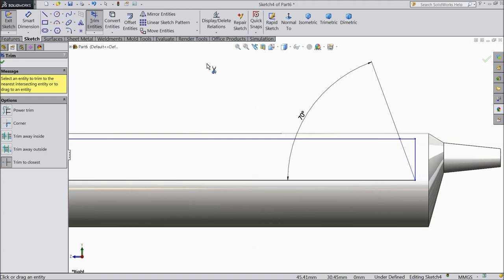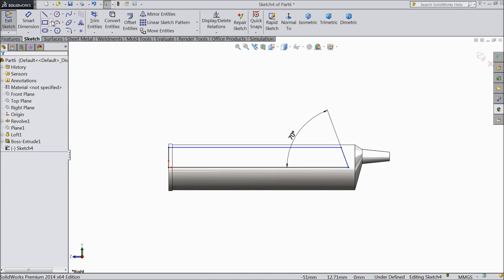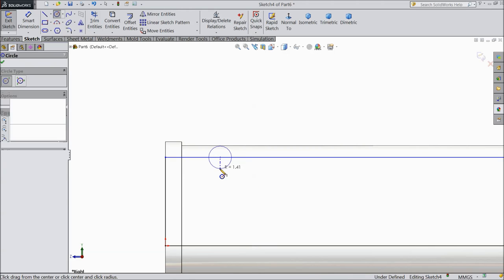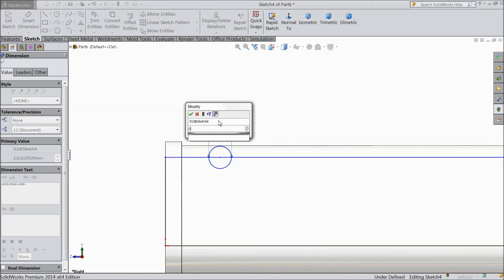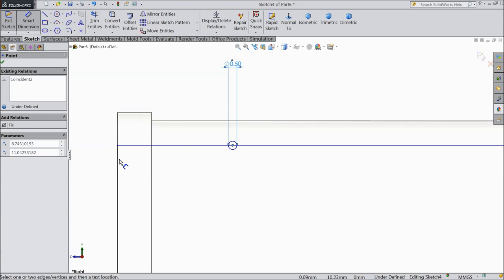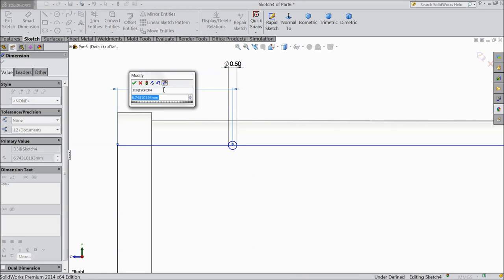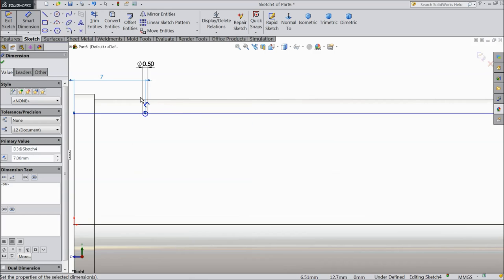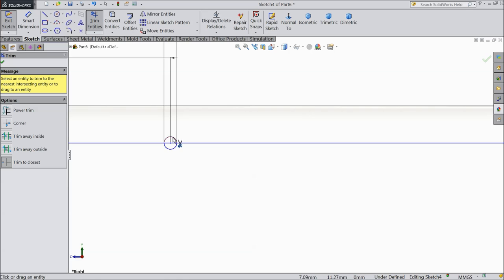Choose trim entity and trim these outer faces. Now select circle and draw one circle here, keep the diameter 0.5mm, and the outer distance 7mm. Trim this outer part.